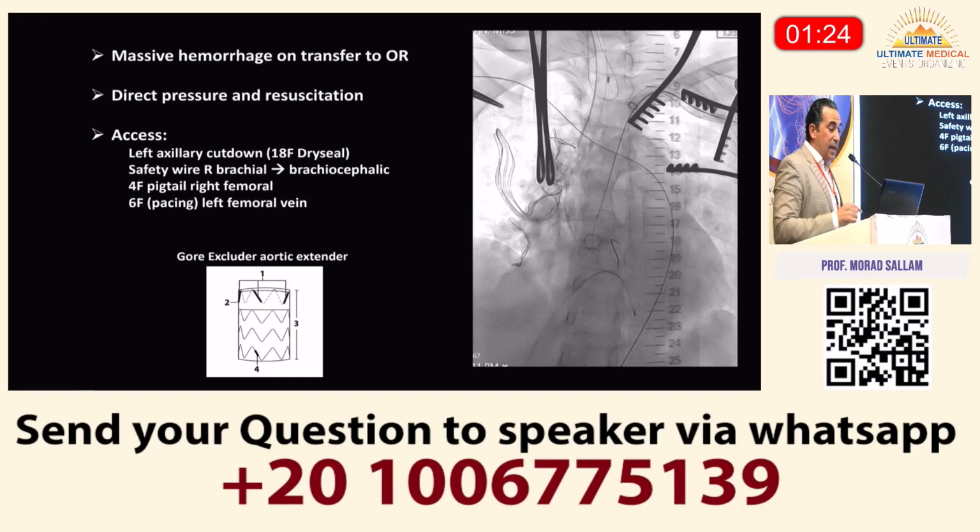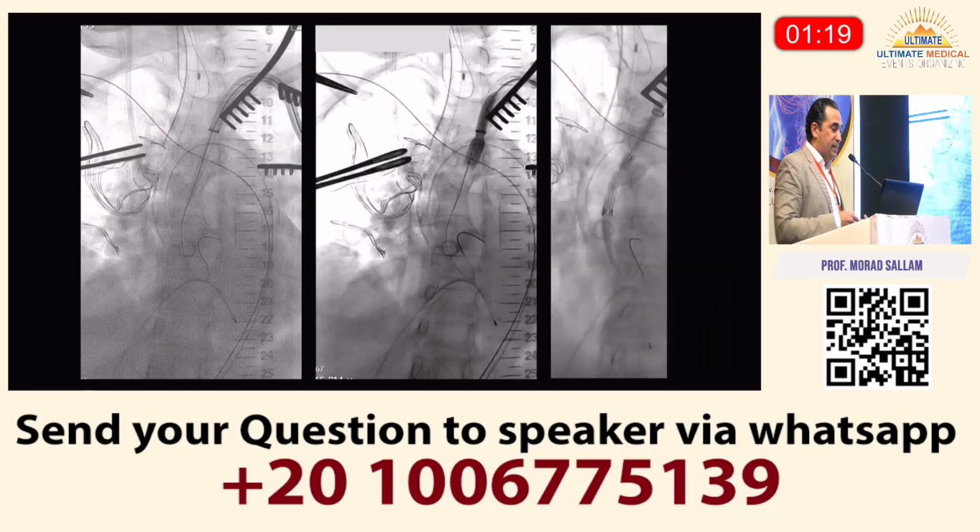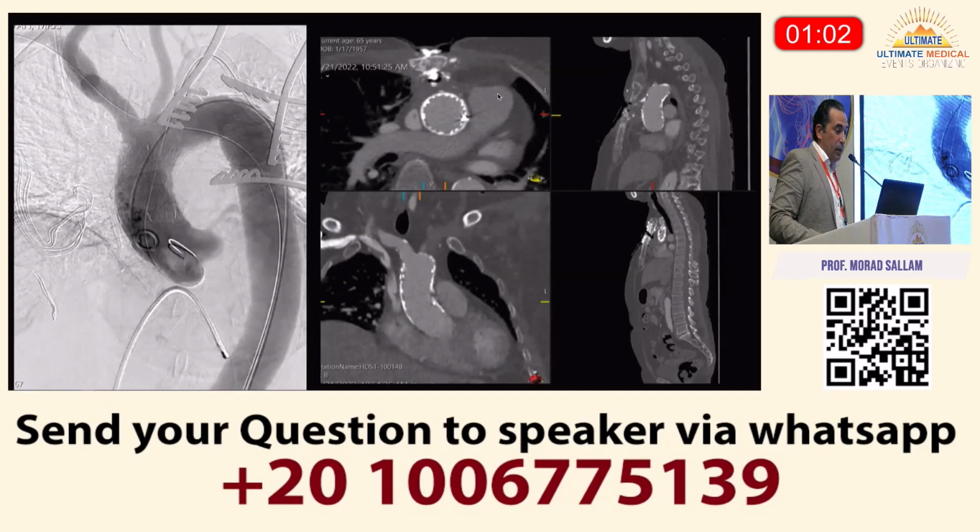It couldn't have taken anything more than that. With access from the axillary artery, and we ended up landing the rapid pacing. You can see here that the graft is being deployed. We came from the axillary because the delivery system doesn't get you from the femoral up all the way to the coronaries. And we deployed it on the rapid pacing wires and ended up with this.